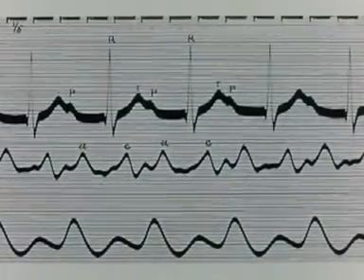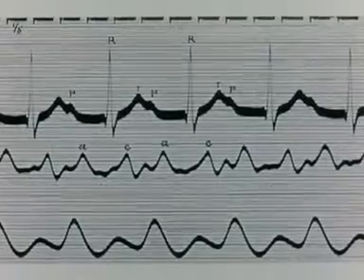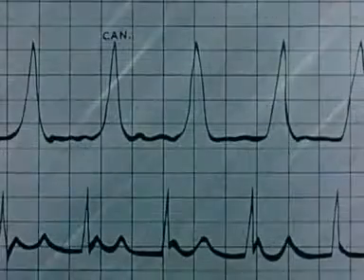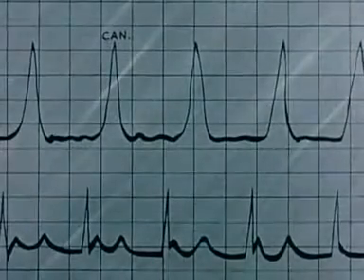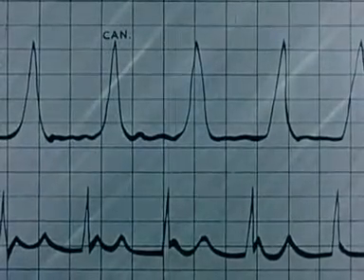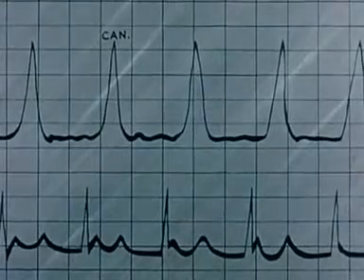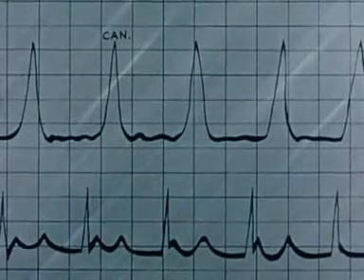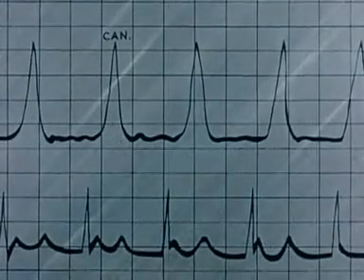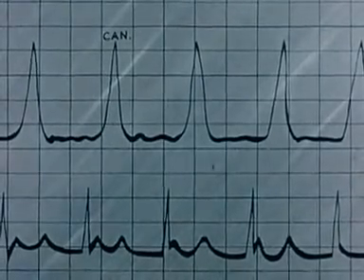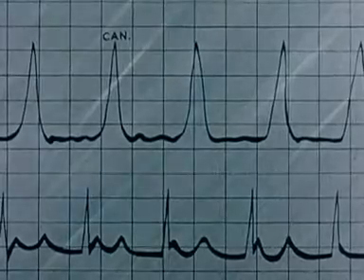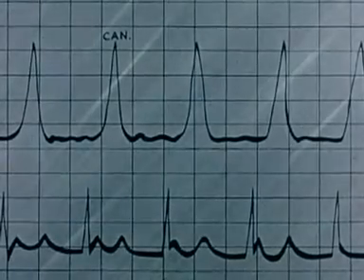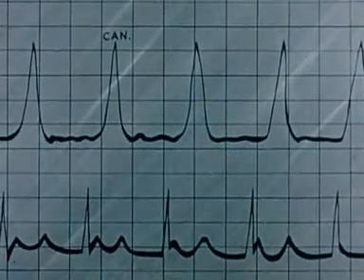The jugular phlebogram is the middle tracing shown. A cannon wave is a particular form of giant A wave and occurs when all the energy released by right atrial contraction is translated into pressure because forward flow is impossible owing to simultaneous closure of the tricuspid valve.